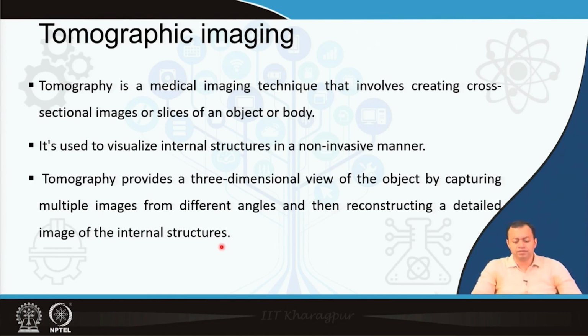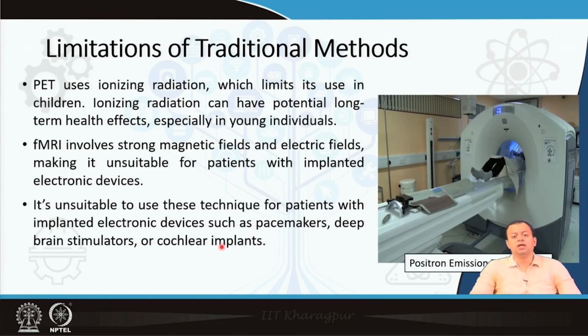I am using the term X-ray because CT scan, computerized tomography, is something probably all of you have heard of, but we use something similar with the brain and obviously not with X-rays. X-rays will most definitely fry up the brain. So, you use basically a non-ionizing radiation method, the radiation that is absorbable or transmittable depending on what we are looking for.